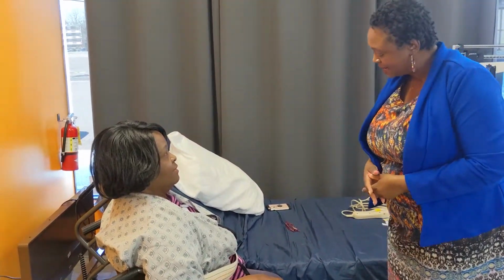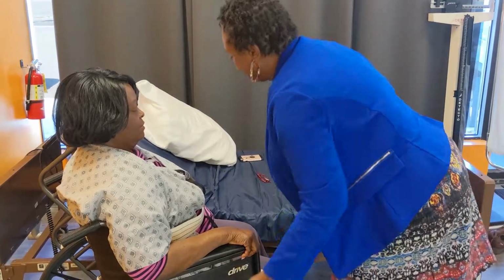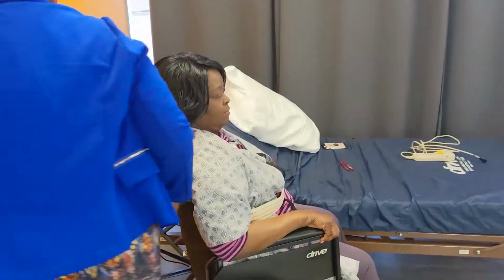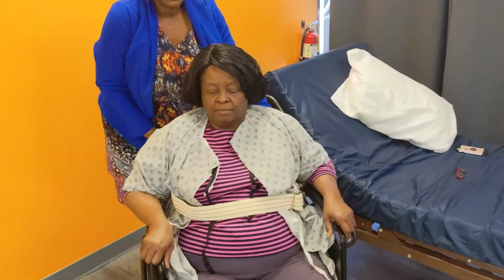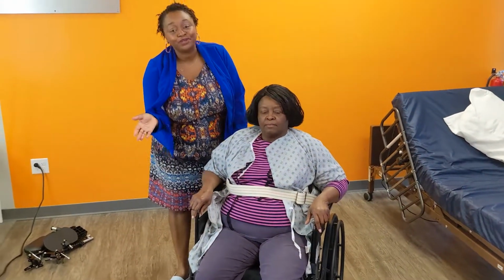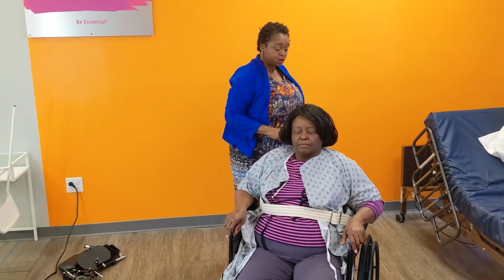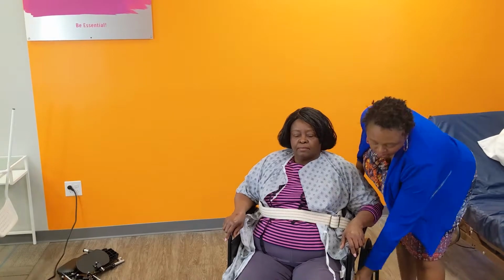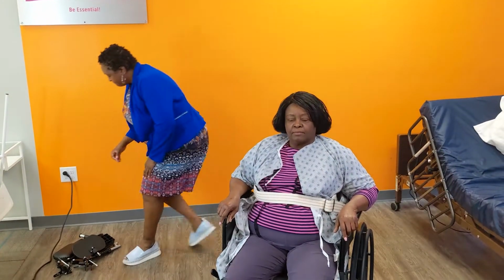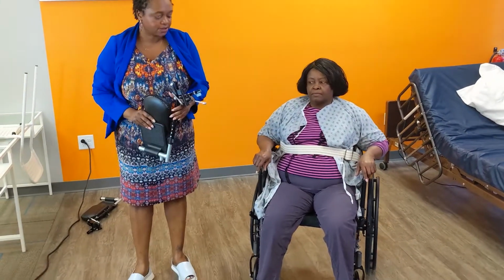Now, once the patient's done, I think you might have taken like 1 or 2 little micro steps there, but you know, with practice, I unlock the wheelchair. And the skill's not done. Let me just say, we wheel her to our cafeteria. Wherever you're gonna bring her, again, make sure you lock it. Locking of the chair is extremely important. And so you still can't leave her like this. You have to put the footrest back on. And so that's why you notice that you couldn't do it with the footrest on.